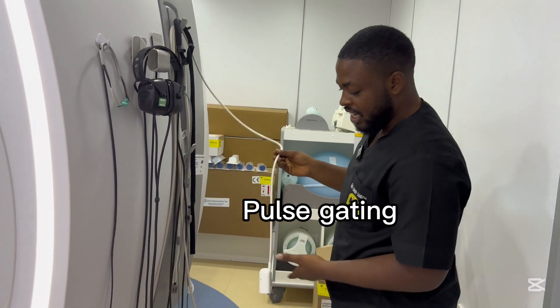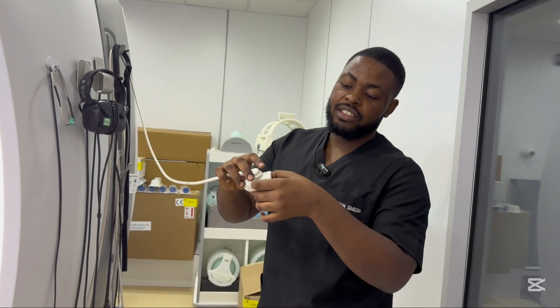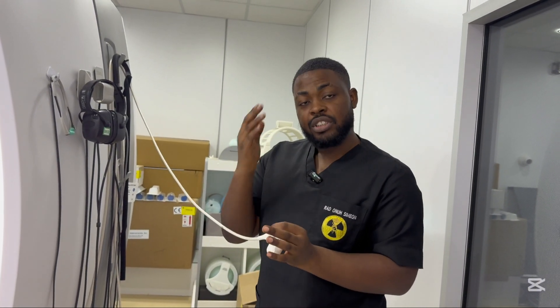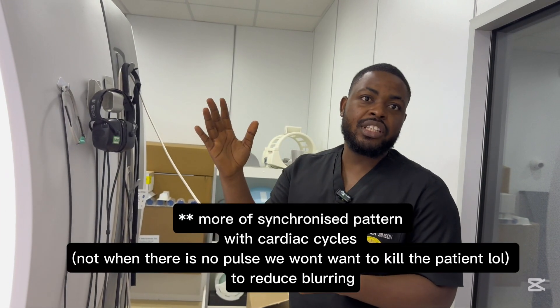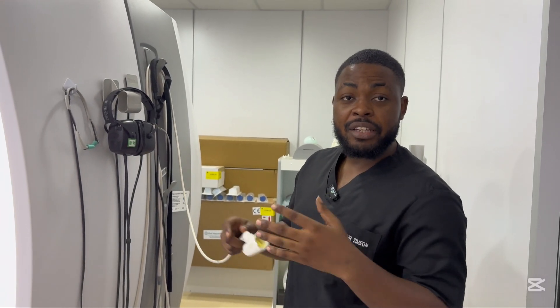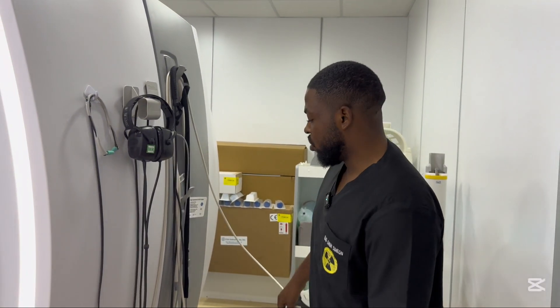This here is called pulse gating. You just place it on the person's finger like this. We use it to check the pulse so the machine can take images in between when there's no pulse activity. We use it when we want to do CSF flow studies, lower and upper limb angiography, and other vascular examinations.